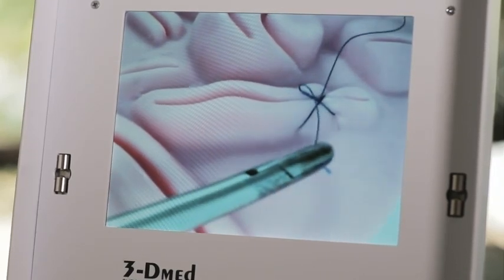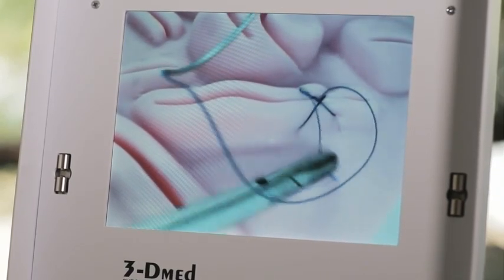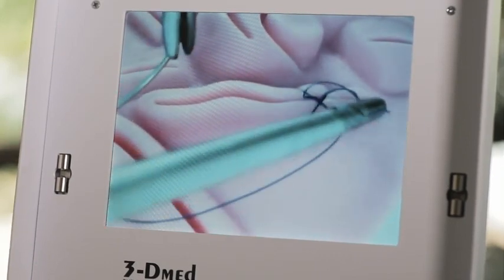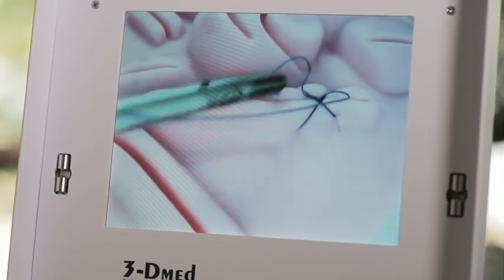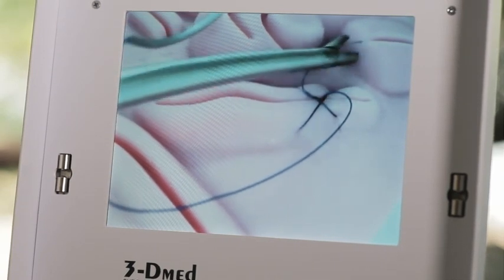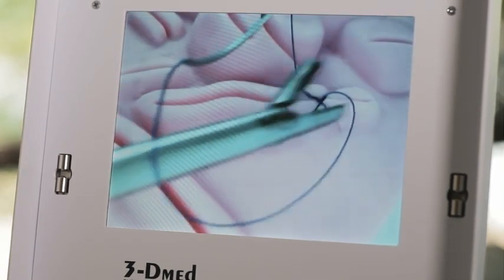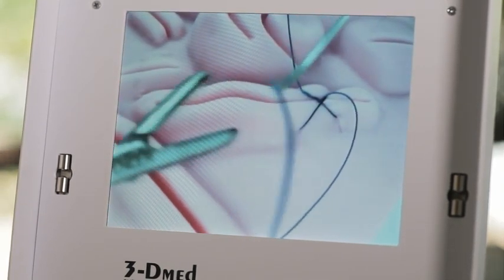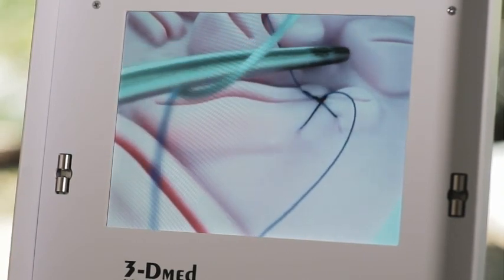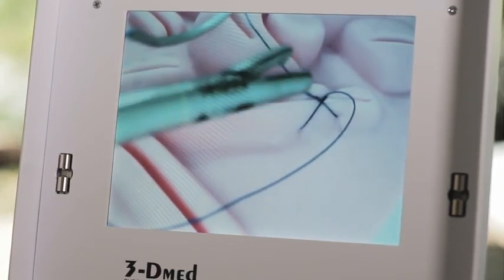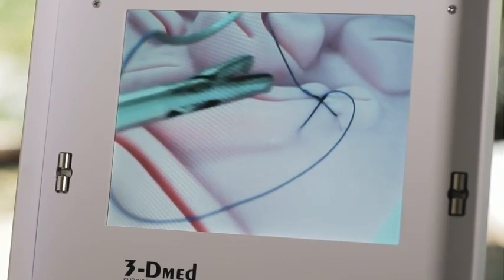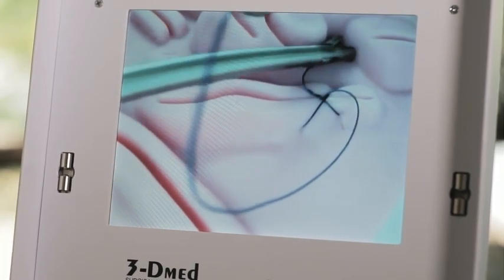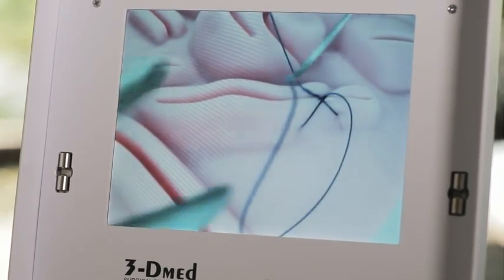Now for the second knot. I've placed a surgeon's knot there. In real tissue I would place this suture back on the moist tissue to hold it there so that after I make my next knot all I need to do is lunge forward to pick it up. But in this model we can't get this to stay.